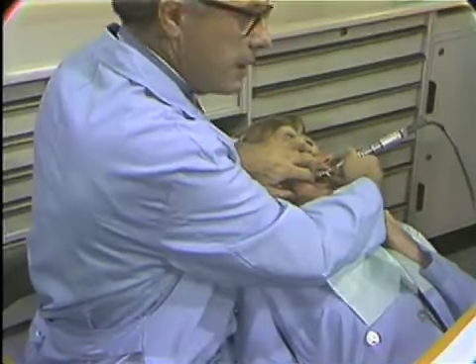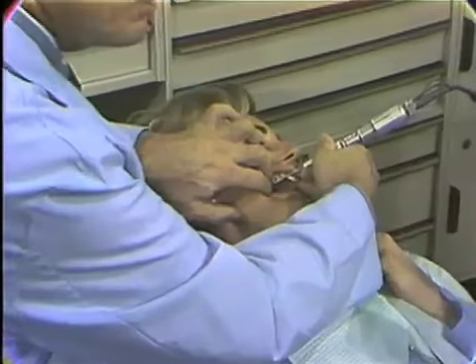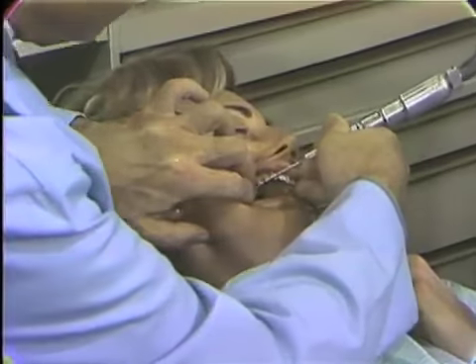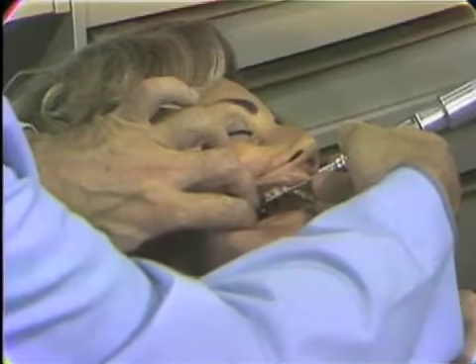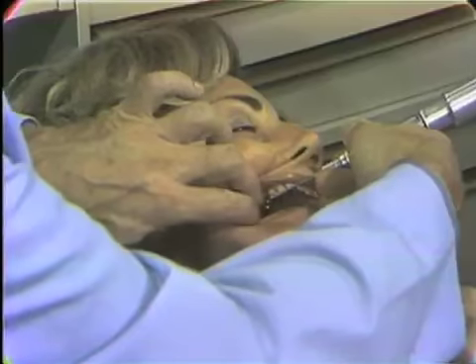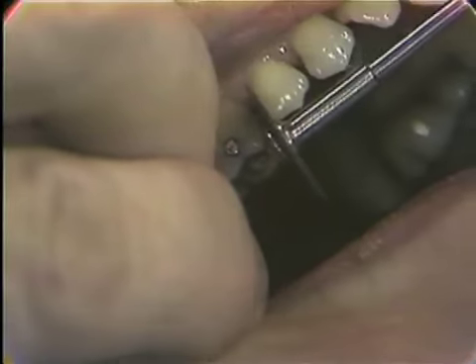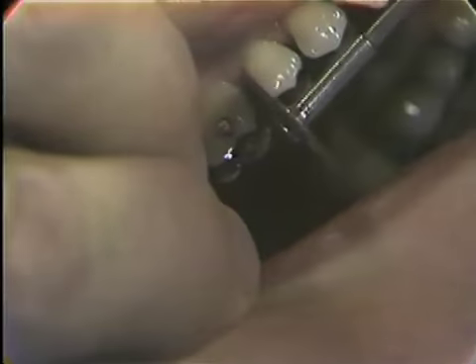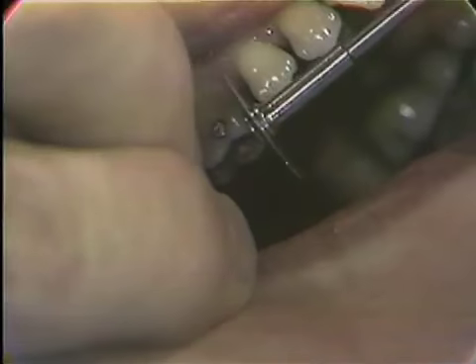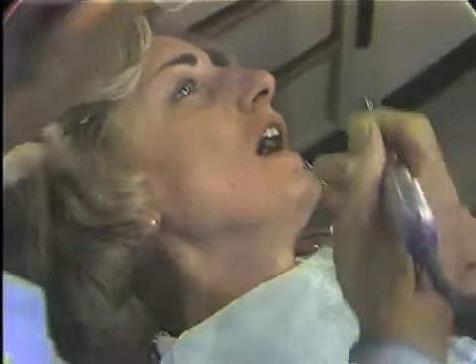Then the handpiece is placed with a firm pressure. As you notice here, I have a firm pressure with my 4th finger on the patient's opposite lateral. And we now will come in and show a close-up of the disc in position against the tooth. Then, in this position, it is possible for the operator to tell the amount of taper, as you can see, as I'm bending my disc back and forth. You can see the amount of taper and thus reduce one of the tendencies of placing too much taper on the tooth. Now, if we can widen the shot, I can show you then how we will slice the lingual.